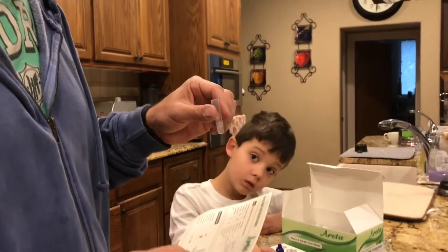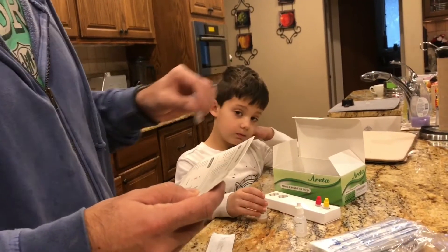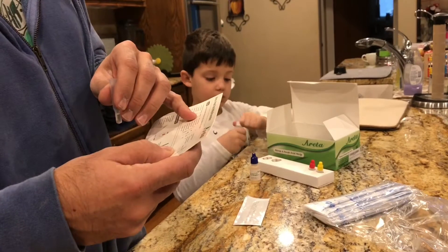Let me just read the instructions to make sure I've got it right: hold the reagent bottle upright, four full drops of A and then B, and then shake the tube gently.